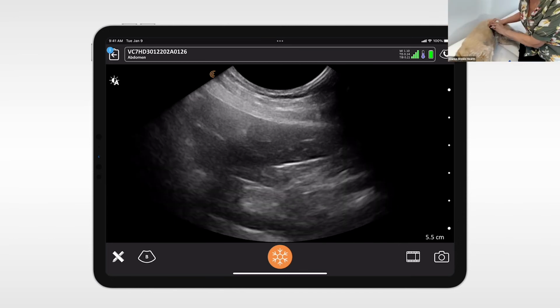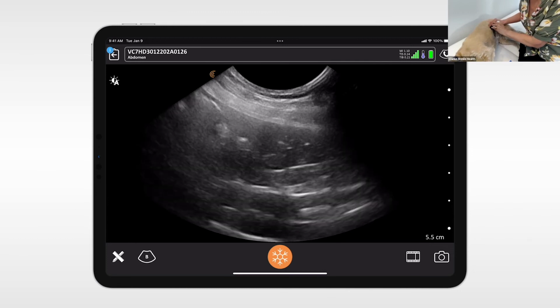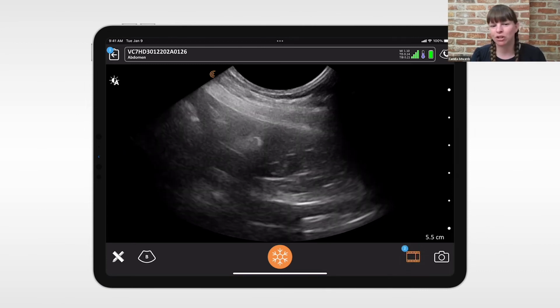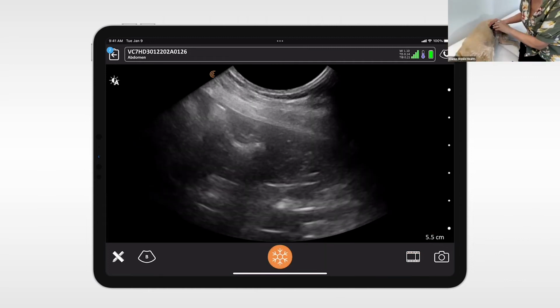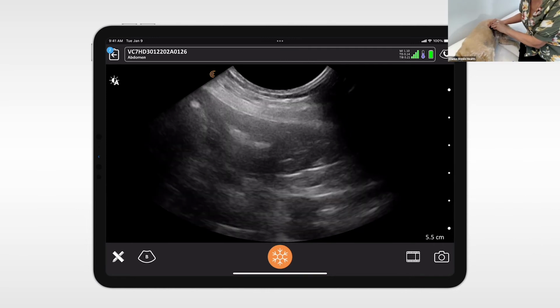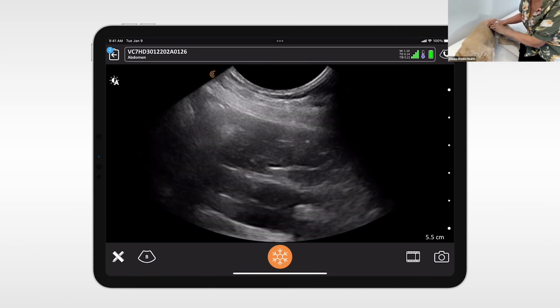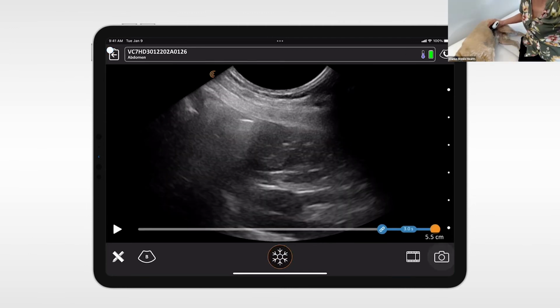Okay, so I just eased off on the pressure a little bit, and I got a much better image. So yeah, it's like you were saying. Exactly. That can really improve the image, just releasing that pressure, so not everything's all squished together in that area. That can give room for the lymph node to be. But we do have the descending colon on that side, and sometimes that slips in as we release the pressure, and you can just get gas artifact then. So it's a balance between releasing as much pressure as you can without letting the descending colon get in the way.